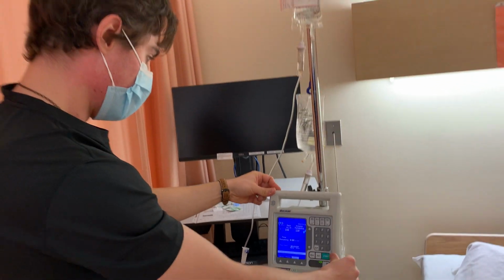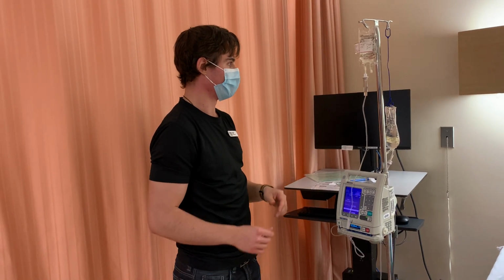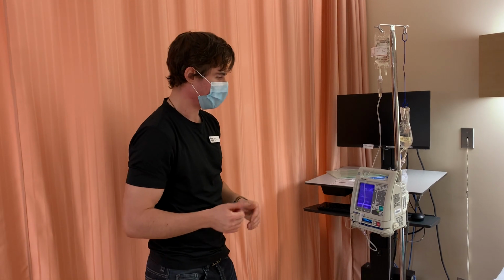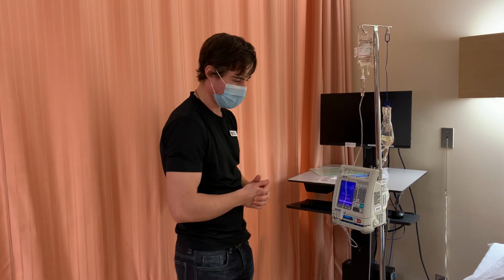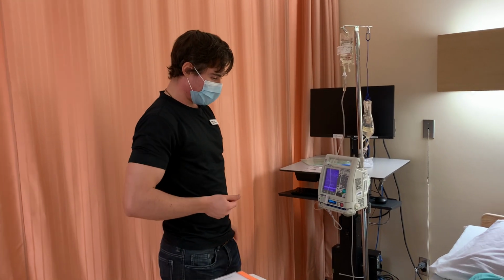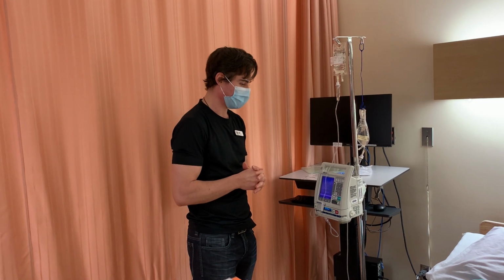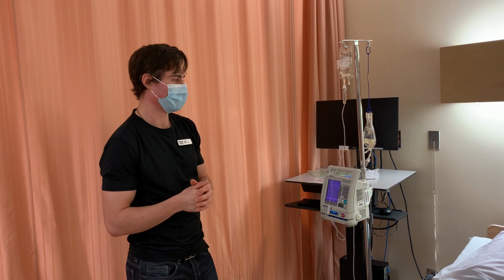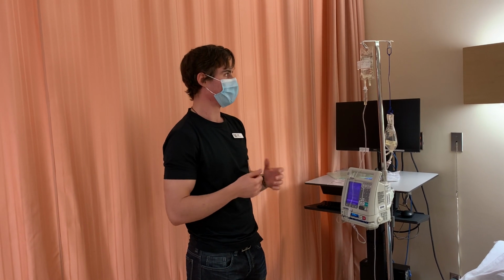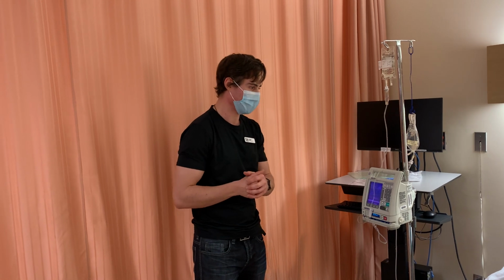I'm going to hit confirm secondary and then hit start. I'm going to wait till I see 3 drips. So 1, 2, and there's 3. So after I see 3 drips, I'm going to let her know that your medication is infusing now. I'll let her know that if she has any of those side effects, please ring the call bell and let me know. I'll come and assess. I'll let her know I'll be back in half an hour to program in a 15 ml flush at the secondary rate to make sure she does receive the full dose of the medication.